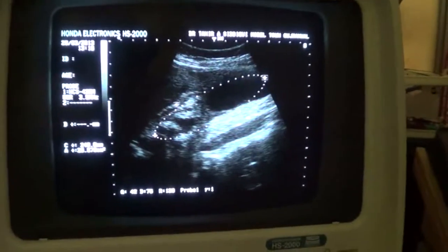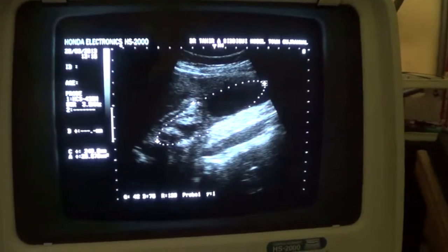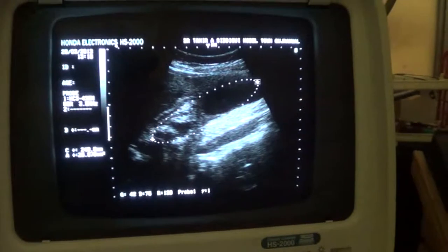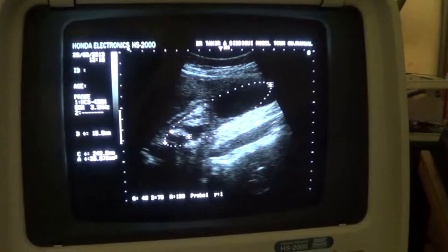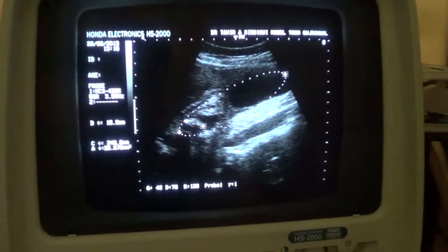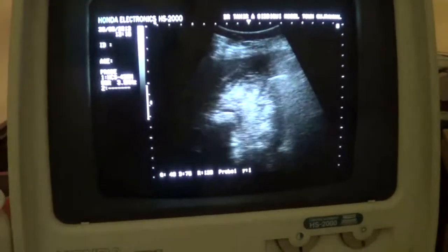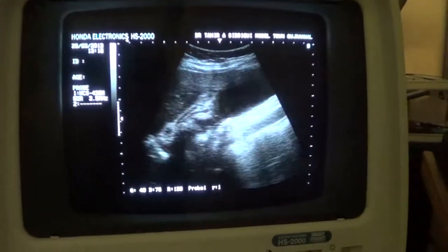Here you see a thin ring of fluid around the posterior segment of the anterior wall of the gallbladder in longitudinal section. There are calculi within it. This is a calculus. Now the largest of these calculi measures 15.9 or 16 millimeters, and this is a case of pericholecystitis or acute cholecystitis due to a 16 mm calculus that is impacted in the GB neck region.